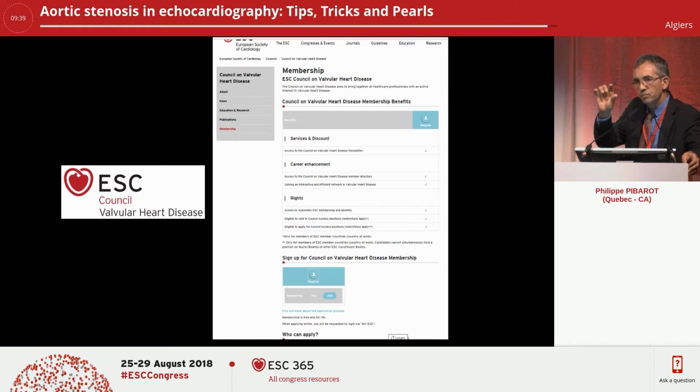The sample volume should not be too far in the ventricle because you're going to underestimate the velocity. Should not be too close. We're often tempted to be close to the valve because generally you have a nicer signal, but you have to be careful because if you start seeing some clicks on your pulse wave Doppler signal, it's probably because you're too close to the valve. You don't want to be too close to the septum because you have some acceleration.